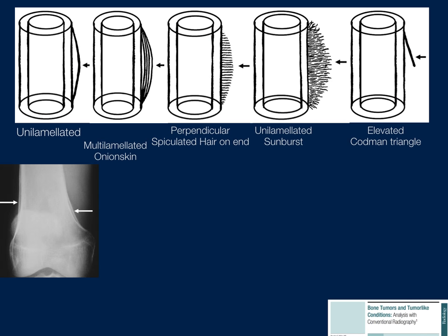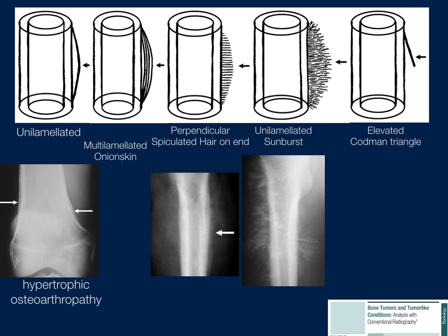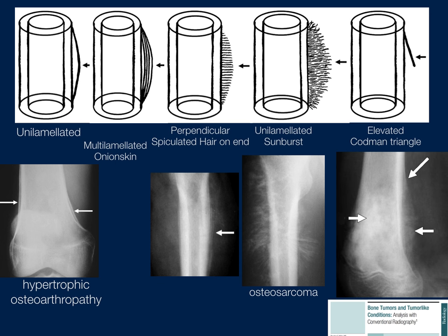Some examples: on the left, a well-defined periosteal reaction seen in hypertrophic osteoarthropathy, which can be seen in patients with lung cancer. Then a perpendicular, spiculated hair-on-end lesion. Even more aggressive is osteosarcoma, and the most aggressive being the Codman triangle.